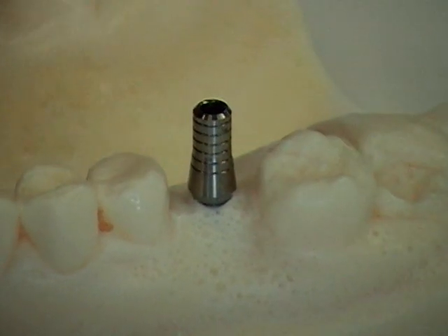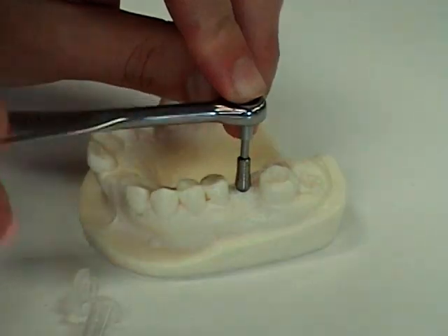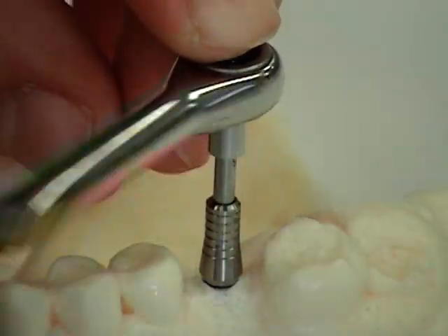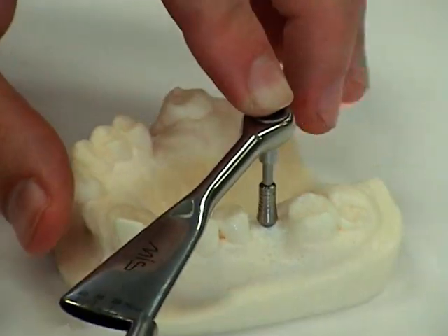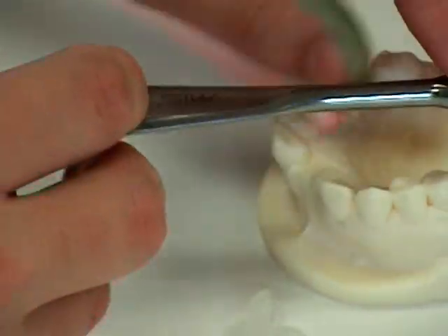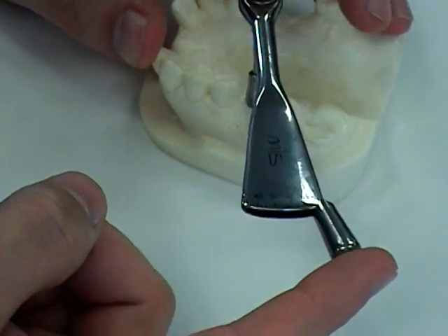We will place the abutment in and attach the torque wrench. Now when we feel the screw begin to tighten, we can check the torque by pushing only on the outer part. When it becomes difficult, it will provide some resistance, and we can measure the torque. This is the most important part — the screw is tightened and we can check the torque using the outer portion of the torque wrench.